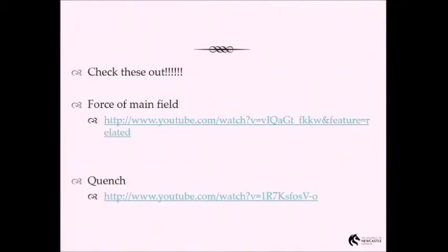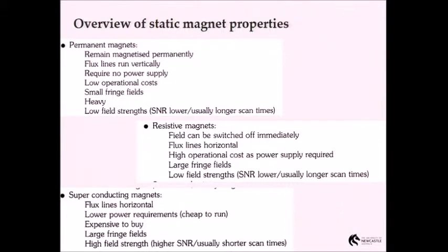So Helen's just left a couple of sites here for you to look at. One, this magnetic force one, is probably similar to what I showed you before, where some guys have just taken some objects into a magnetic field and show you the forces behind it. This one here is one of a quench, which I show the third year students, so you'll see it next year, where they were decommissioning a magnet, and there was a TV crew there watching what was going on, and the thing quenched in front of them, and you just see gas and bits of shielding go all over the place. Interesting if you want to have a look.